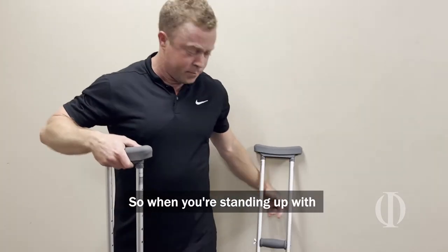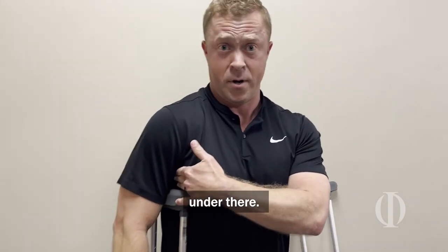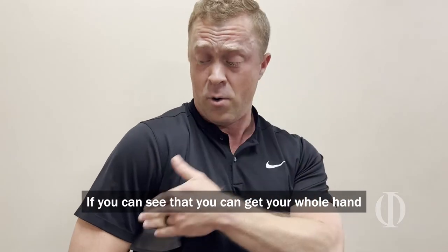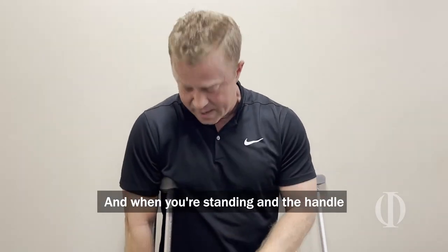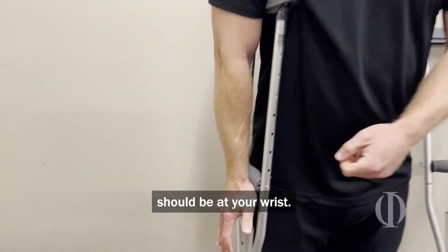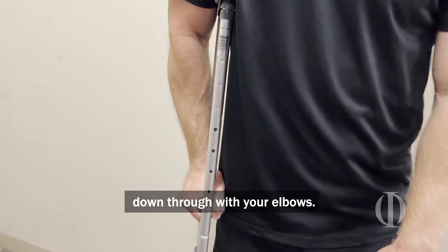So when you're standing up with a standard crutch under your armpit, you want to be able to get two or three fingers under there. If you can get your whole hand under there, it's certainly too low. And when you're standing, the handle should be at your wrist. With the handle at the wrist, what it allows you to do is to be able to put pressure down through it with your elbows.